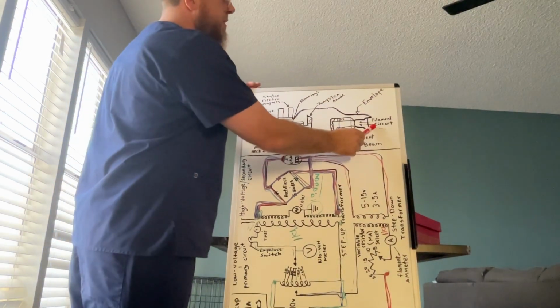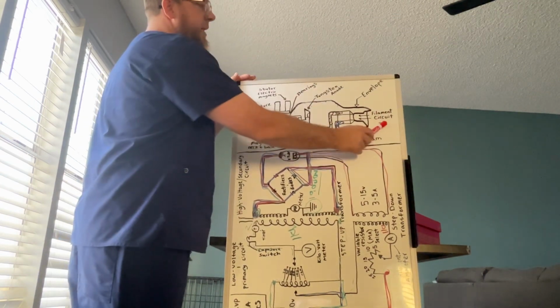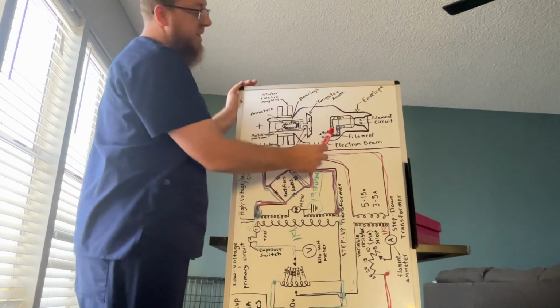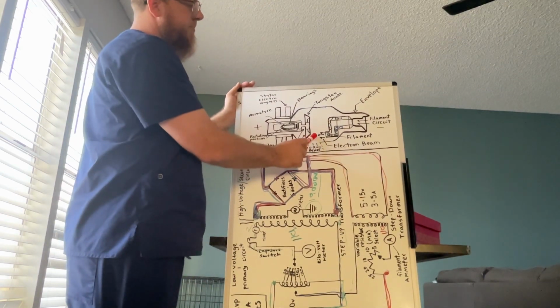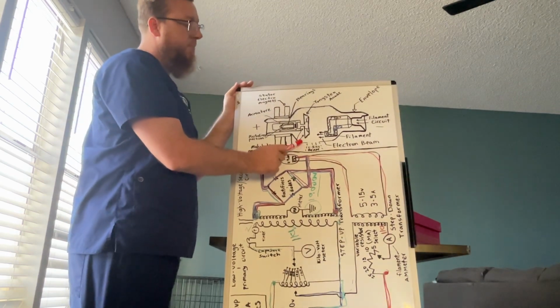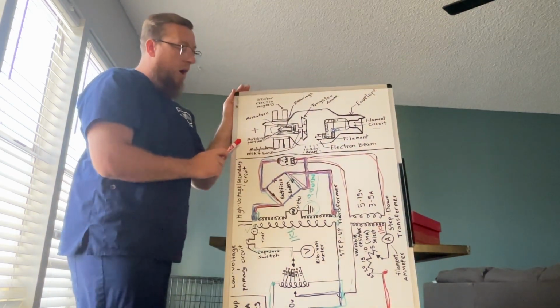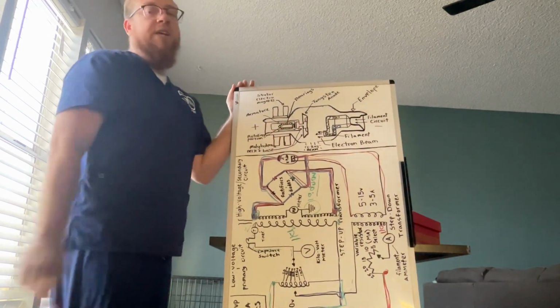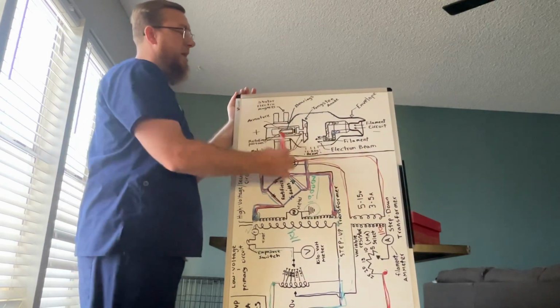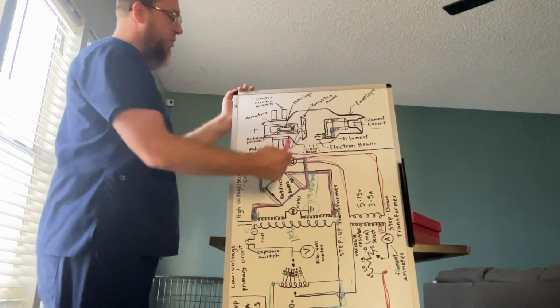We're going to have our filament circuit, also known as our cathode side, which is our negative. Our filament inside of the cathode. We're going to have our electron beam, our X-ray beam, which is the goal of all of this happening. Our molybdenum neck and base, which is a metal that's made to withstand high voltage and high heat in the X-ray tube.